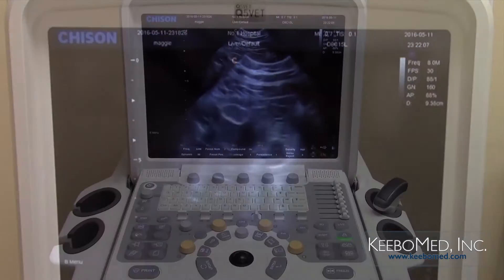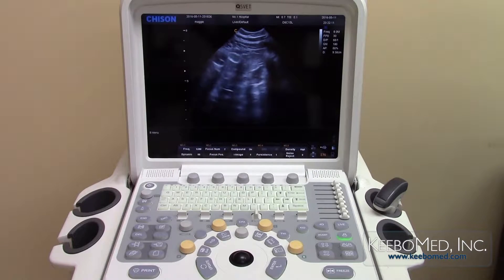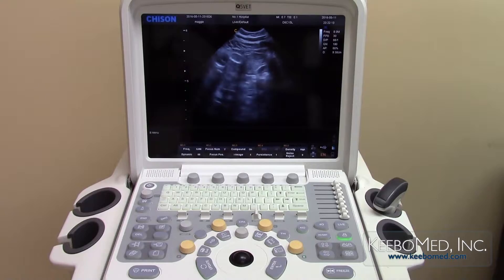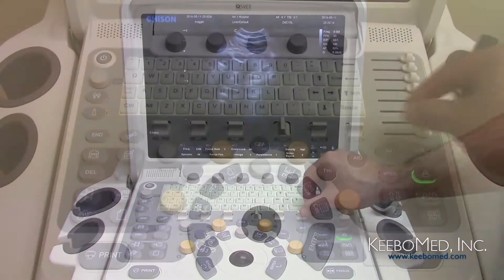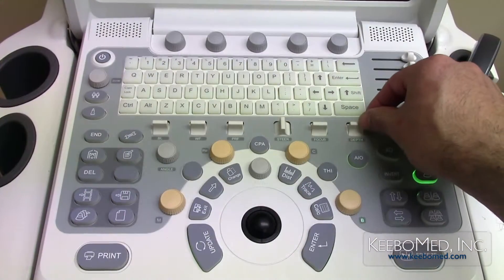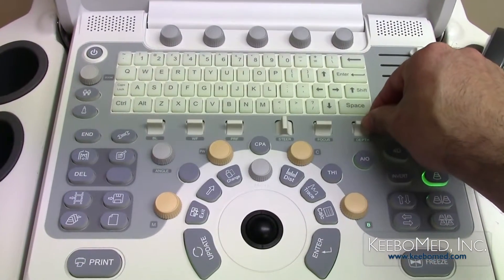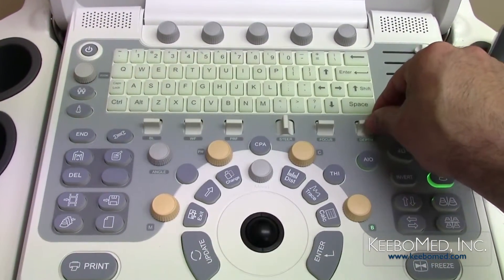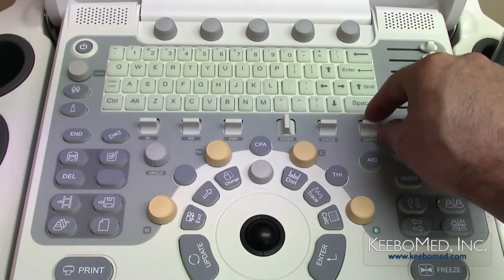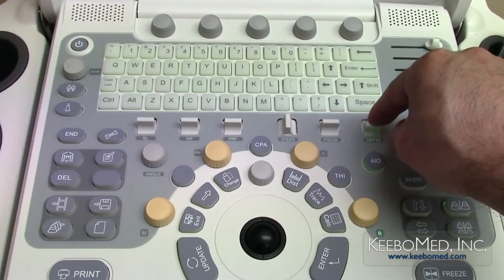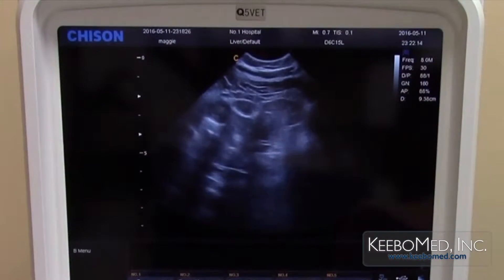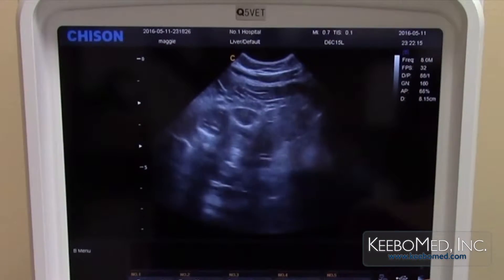Number 3: the depth can be adjusted by using the depth button so that deeper organs can be seen clearly. Moving the key up or down will increase or decrease the depth of the image.